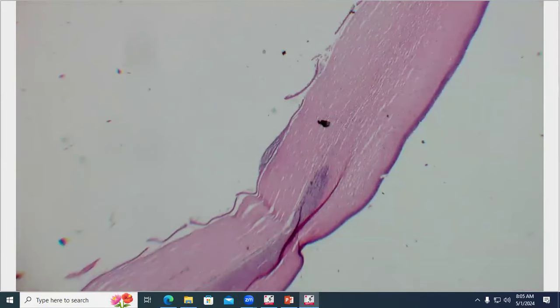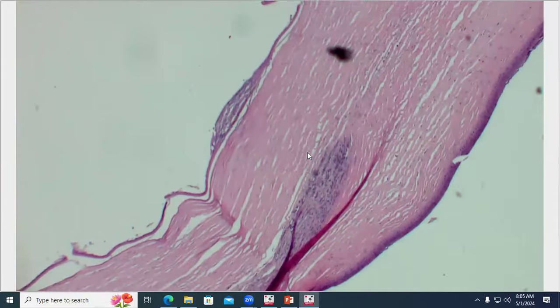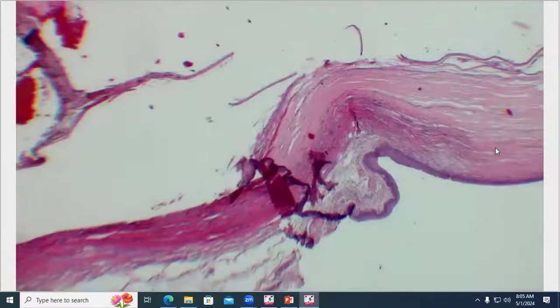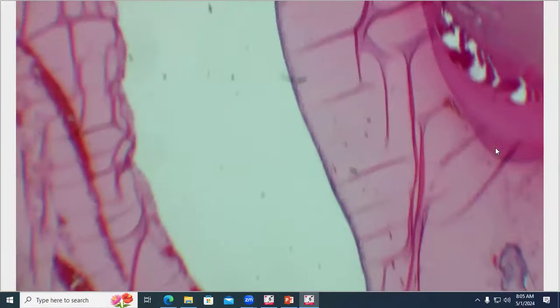Going briefly front to back, we do have this very prominent peripheral corneal stromal vascularization, really dense vessels reaching into the cornea from the periphery. We have these multifocal breaks in Descemet's membrane with this cute little fibrous reaction at the site. So here's a little fibrous reaction bridging that. And these are most likely Haab's striae just because the globe is so huge. Moving towards the back, all of that high protein fluid admixed with hemorrhage.